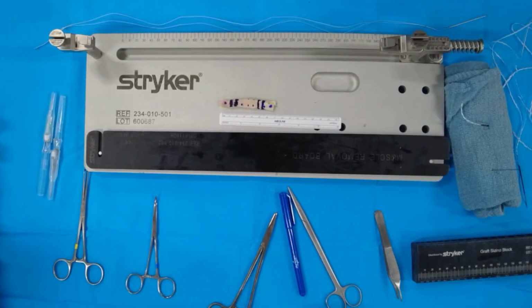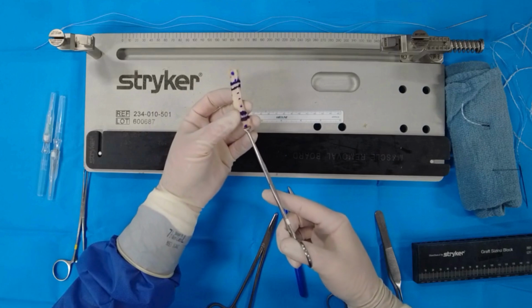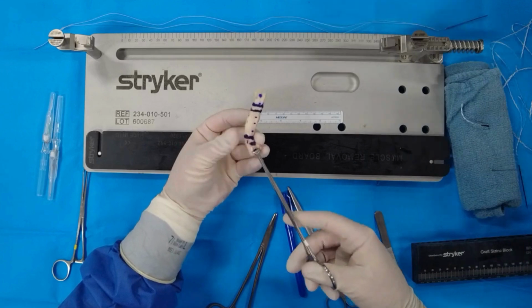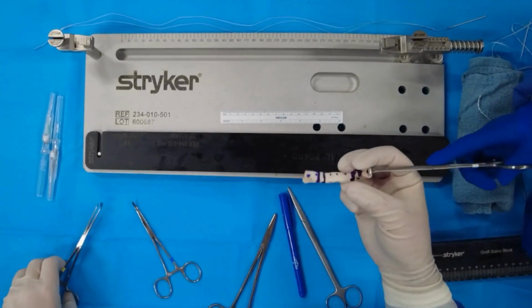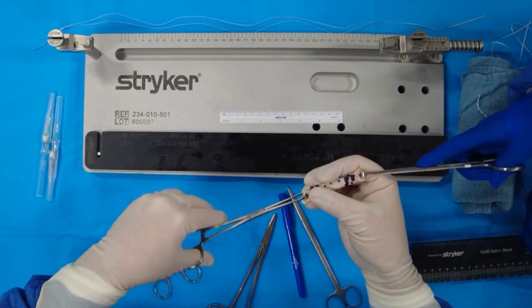Now, this double locking technique, I don't think you really have to use that because it's so robust. But if you're more comfortable placing a tape over top of the graft and using that to help improve some of your fixation, that's how I'm going to demonstrate here, but I really don't think you have to with this technique. And so I'm going to put two Alice clamps on this, and we're going to put this on our graft table.